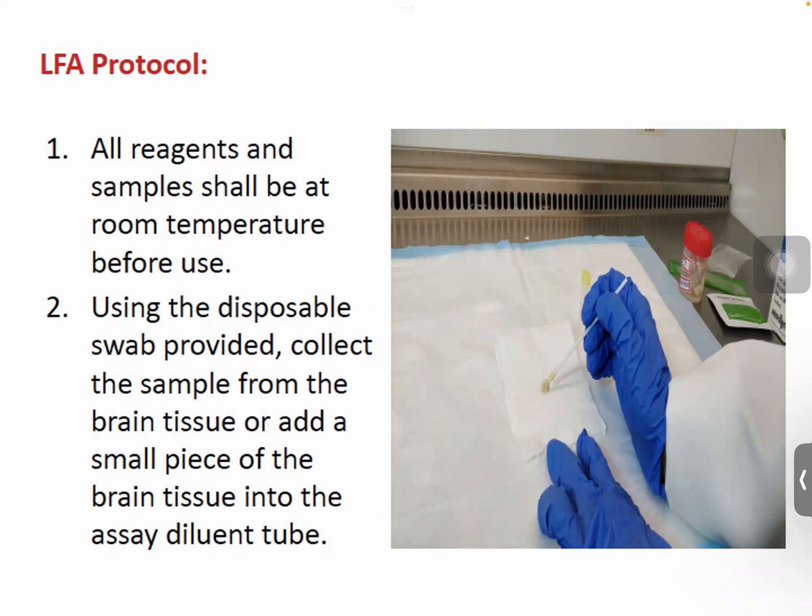So if you choose to commercialize lateral flow, you have to think about the samples themselves, how the sample should be. The sample should be clean, or the person should not be, for example, smoking before the samples are taken, should not eat, should not drink, or should clean their mouth, should clean their nose or whatsoever. Those are very important precautions that you need to put on the kit before getting the samples into the proper buffer and before testing. So that's very important.